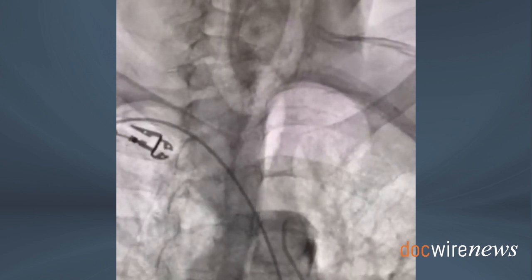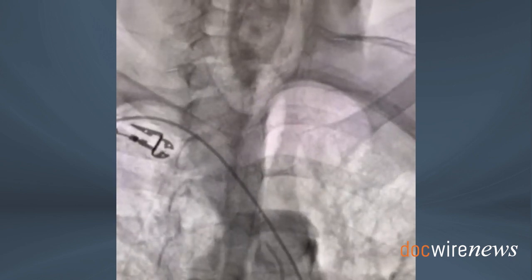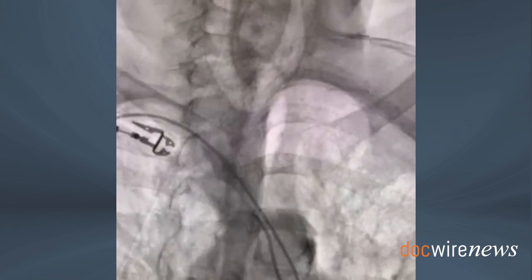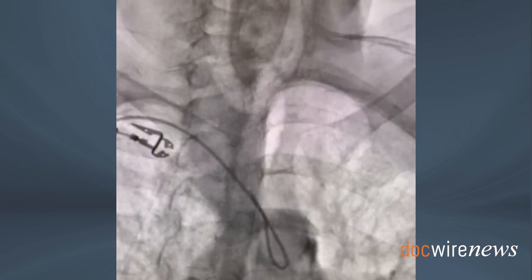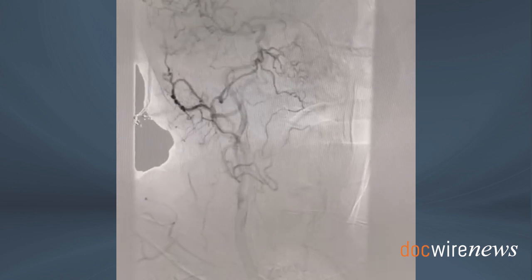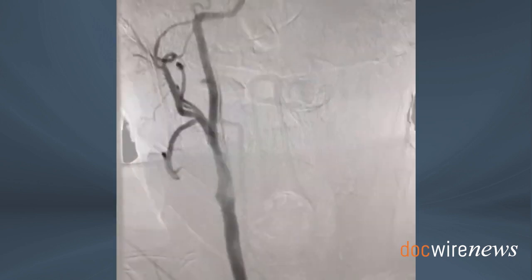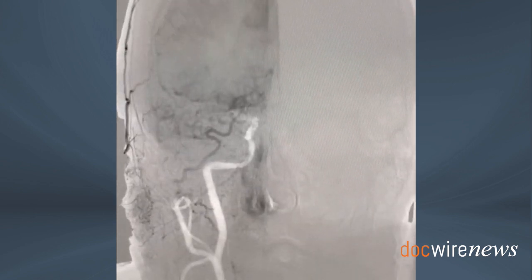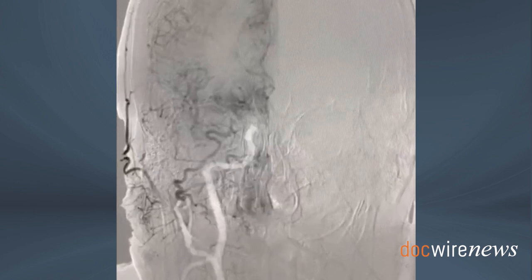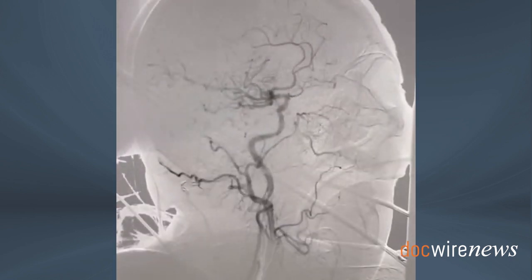At this point, the reverse curved catheter is also extremely helpful, realizing almost a figure-of-eight shape. By pulling it back, we can take an innominate artery angiogram, at which point the catheter is pulled back while being rotated to engage the right common carotid artery, imaged in the anterior-posterior projection, then right anterior oblique projection. No significant stenoses are visualized at the site of the previous endarterectomy. Then intracerebral angiography, anterior-posterior Towne's view, then lateral projection for completeness of the cerebral angiography.